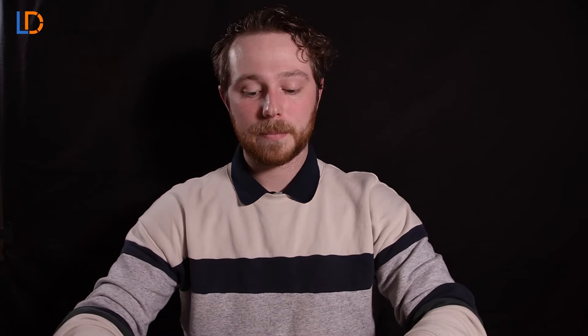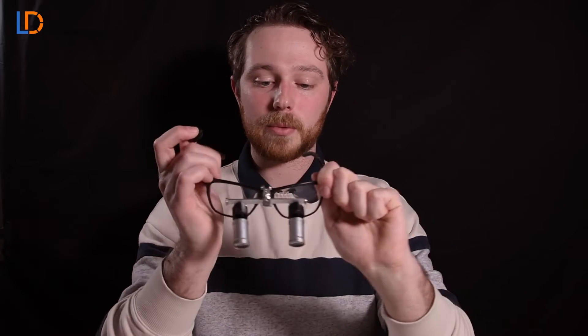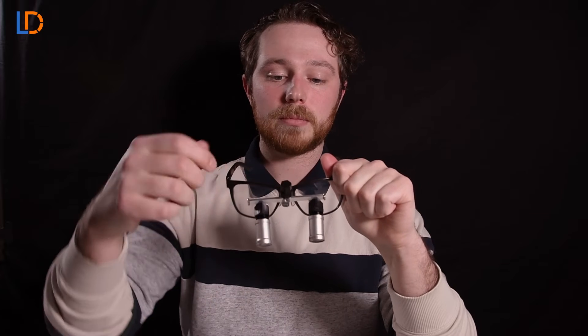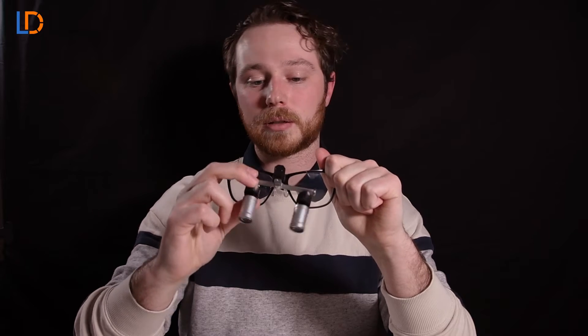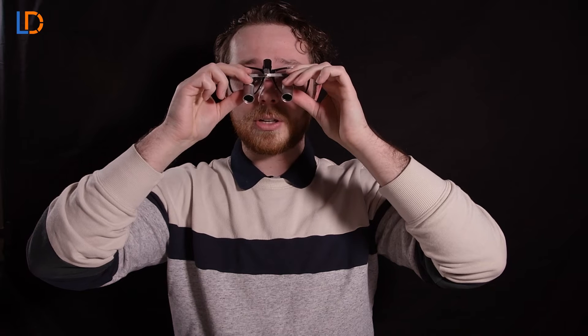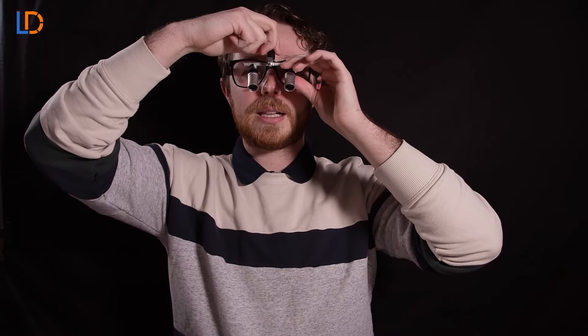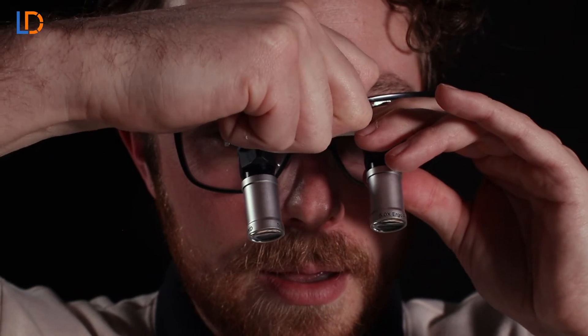Now that you have the frame set up, let's start with setting up the oculars. The first thing you're going to want to adjust is this top screw right here. Grab the tool that we include with every purchase of Varios, pop that on the top screw, and go ahead and loosen it a little bit — not too much — and you'll notice that the bar starts to kind of float freely. Next you're going to want to put these on, make sure the nose pad and temple arms are all good, and adjust the oculars to where you can see clearly through them. Just get it to a comfortable height where you want it to be.